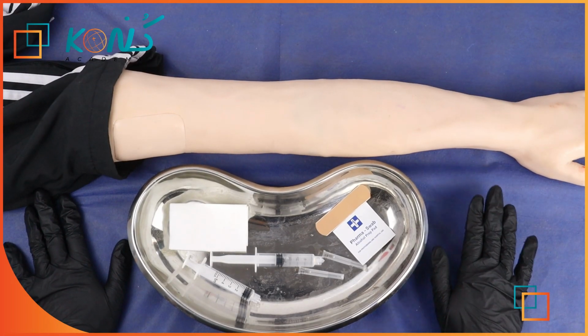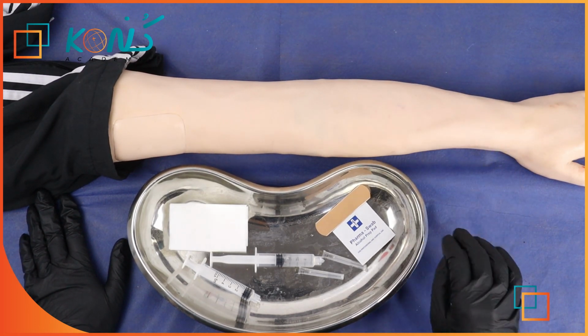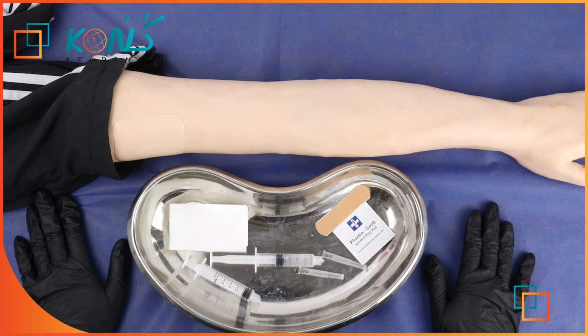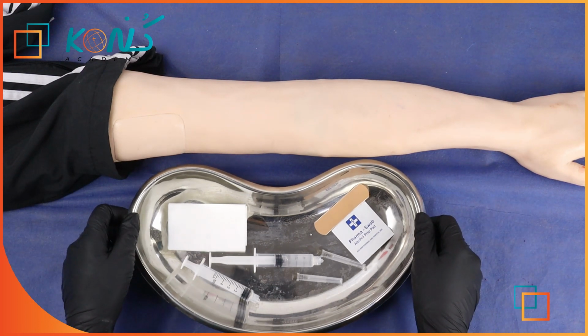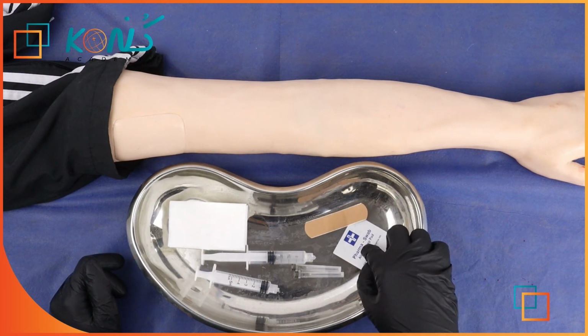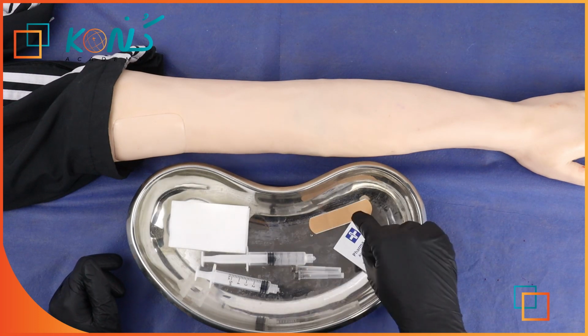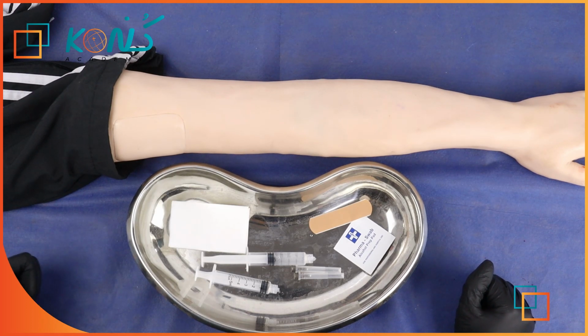Okay, in the exam, you will have a hand mannequin, and you need to teach your colleague how to give subcutaneous injection. In the beginning, you will wear gloves, prepare your equipment. You need 2 needles, syringe, the medication, swab, and cotton and plaster. In the beginning, you need to make sure that you are giving the right medication to the right patient with the right route and at the right time. Then you need to explain to the patient what you are going to do.